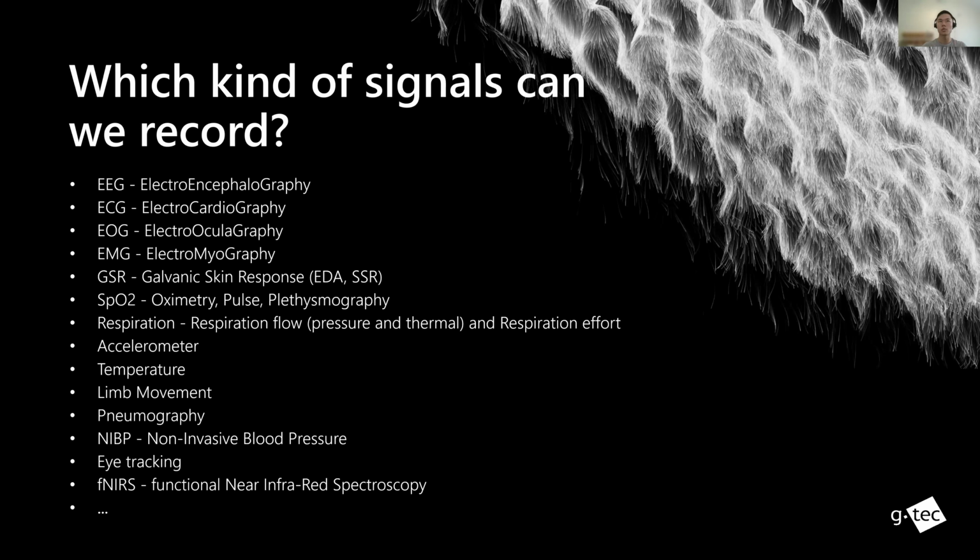So there are lots of possibilities, as you can see here, not just what I list out here, but there can be much more, as long as we can make the devices communicate together through the software or through a hardware trigger. Then you can have multiple modules, multiple dimensions of control of the subjects and the signal itself.